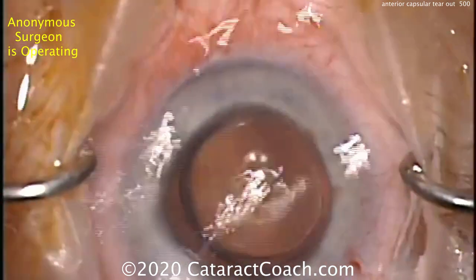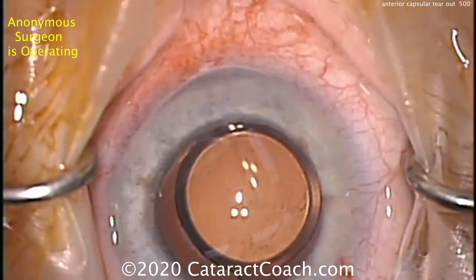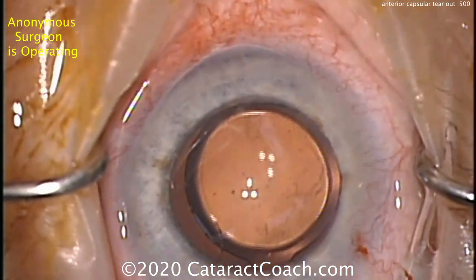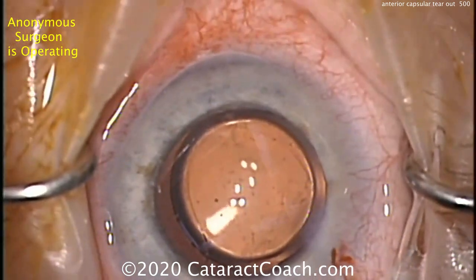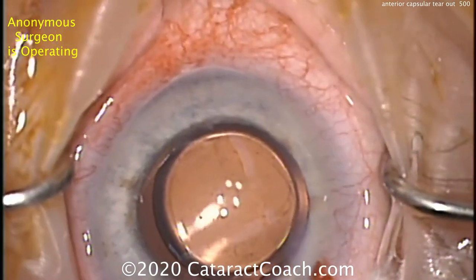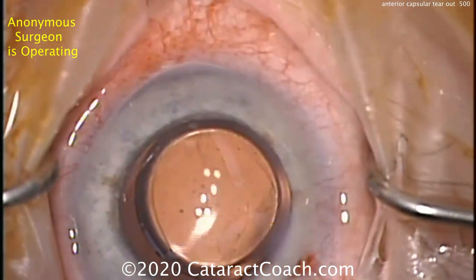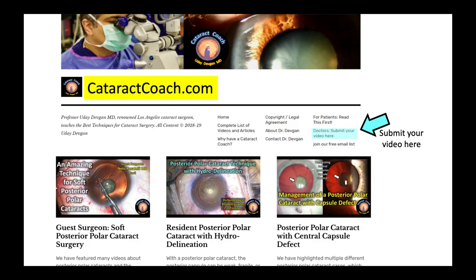What are the long-term results of this? Really nothing. We're going to seal up the incisions now and inflate the anterior chamber. As long as this eye can be held stable in the initial period of healing, there'll be good fibrosis and contraction of the capsular bag, and this is not going to have any deleterious effect on the patient's vision. So this anterior capsular tear, as long as it's managed like it was in this case, can still give you a beautiful result. Nicely managed, anonymous surgeon — thank you for the submission. If you have a good idea for a video, submit it. Go to cataractcoach.com, click on our link, submit your video. We can analyze it here and we'll all learn from you. Thank you.